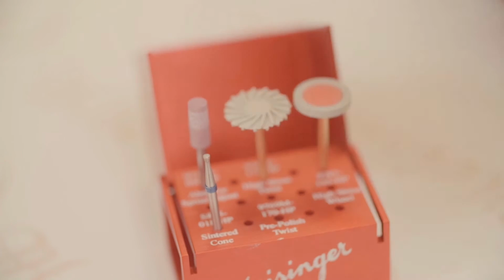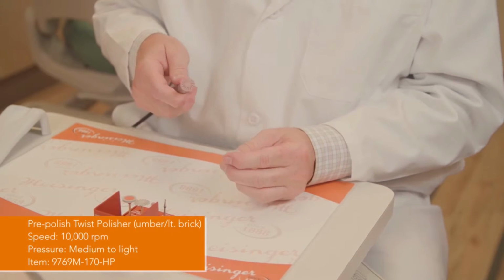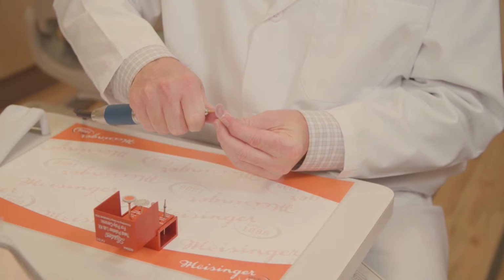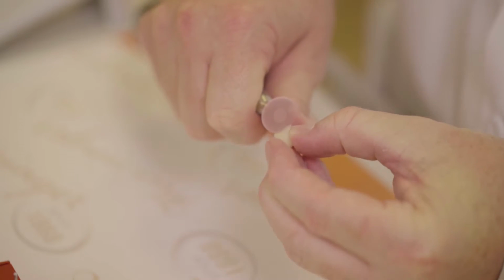We're going to go with our pre-polish twist. We're going to run this at approximately 10,000 RPM. We're going to go medium pressure here, medium to light actually. I'm going to walk that through. So I'm going to go on my facial here.